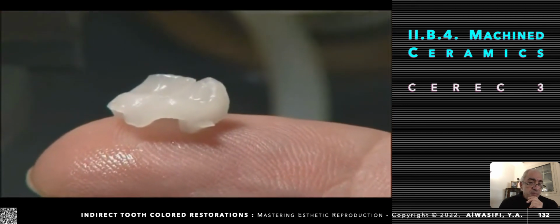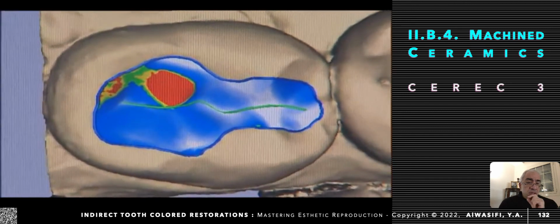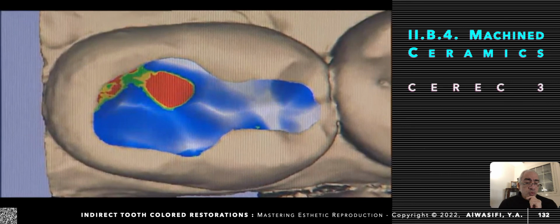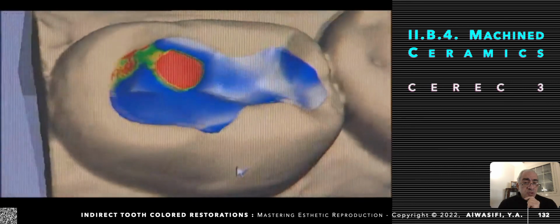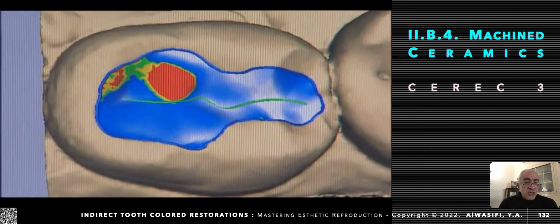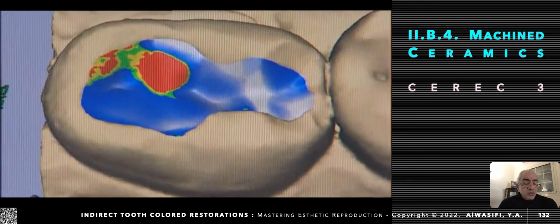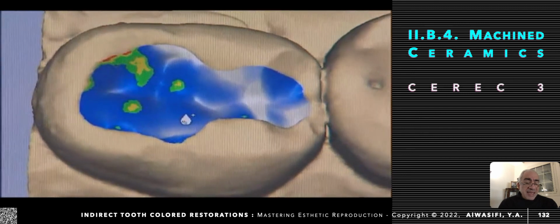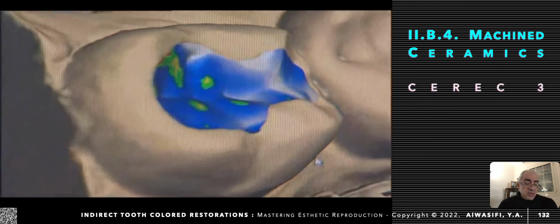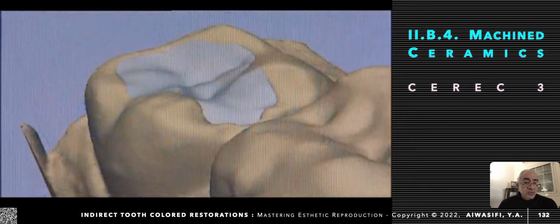And this is the final piece that needs just a refinement to remove this pro-former. This is the other tooth, next tooth, which is the second molar. I don't know why he is going for indirect tooth colored restoration. I don't have any answer for this, because it seems to be a very simple one, not distracted to that extent, you haven't any contraindication to go for direct tooth-colored restoration. Actually, I don't have an answer why he selected or indicated for indirect tooth-colored restorations.